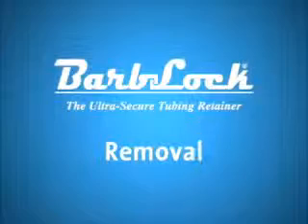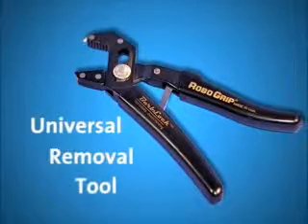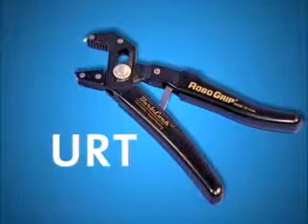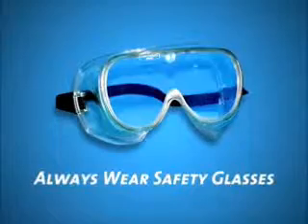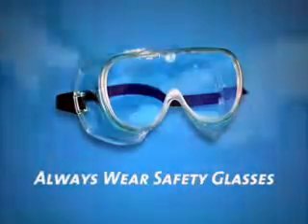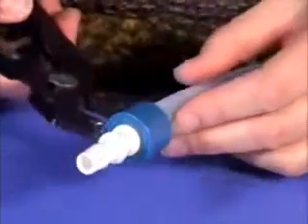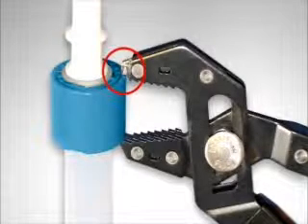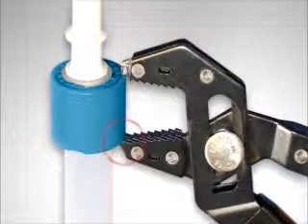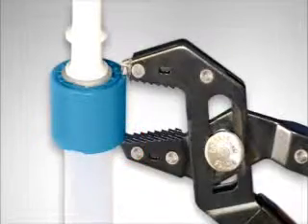Removal. For removal, you'll need a universal removal tool, or URT, to cut off the sleeve in the assembly. Again, please note that safety glasses should be worn when using any Barblock tool. Place the assembled Barblock between the jaws of the URT. Make sure the hooked portion of the upper jaw is sitting on top of the sleeve, ensuring that the base of the sleeve is sitting in the dished portion of the lower jaw.